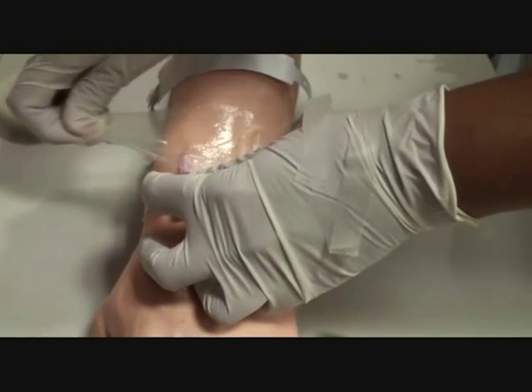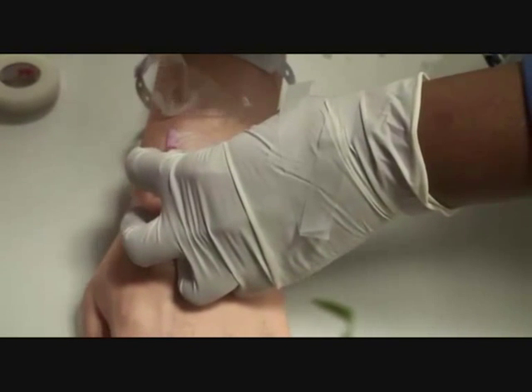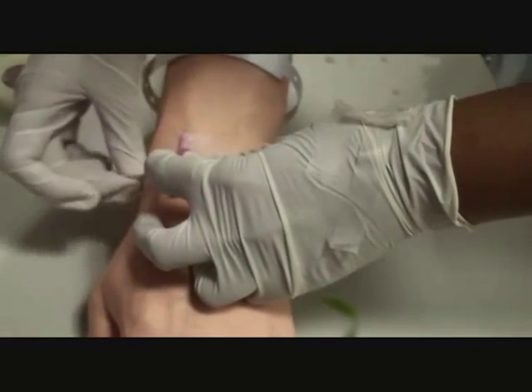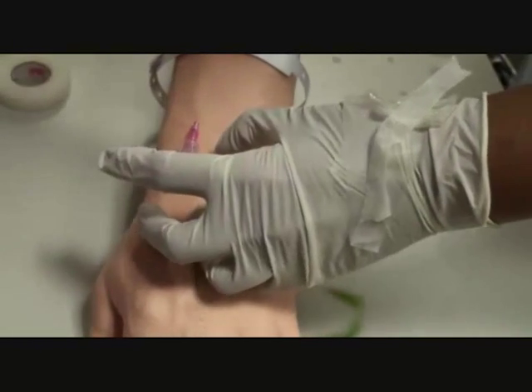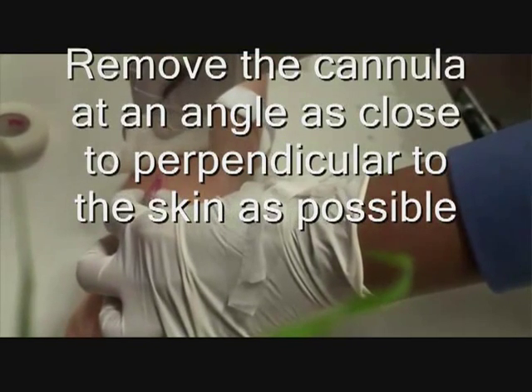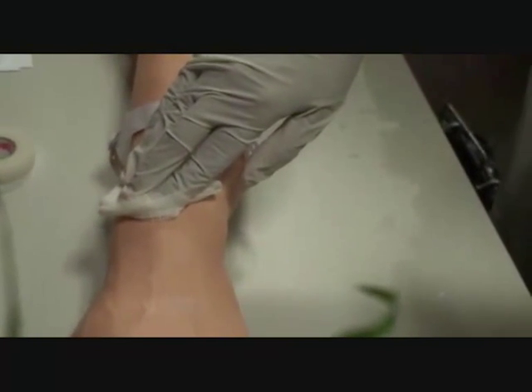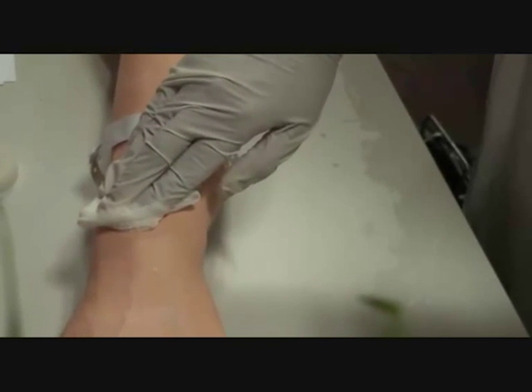Here we go. Removing the cannula. Pressure on the site until haemostasis is achieved.